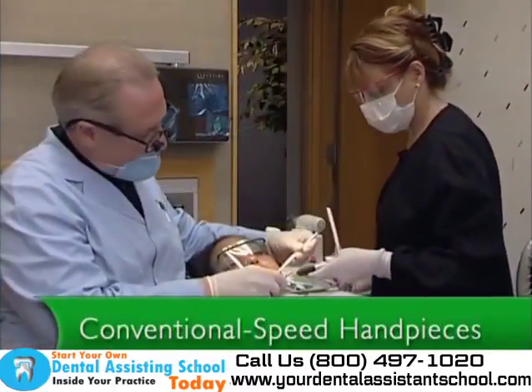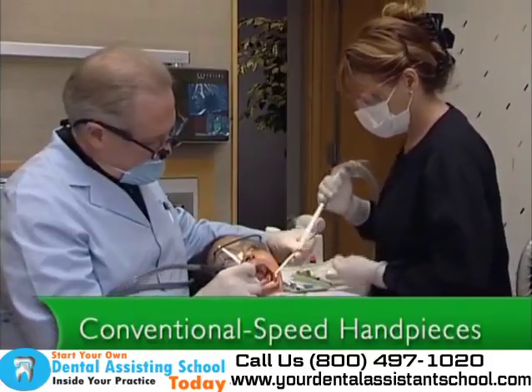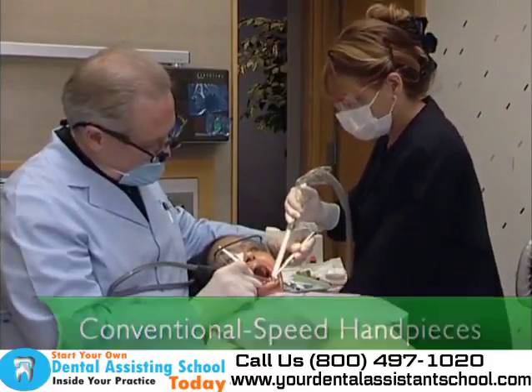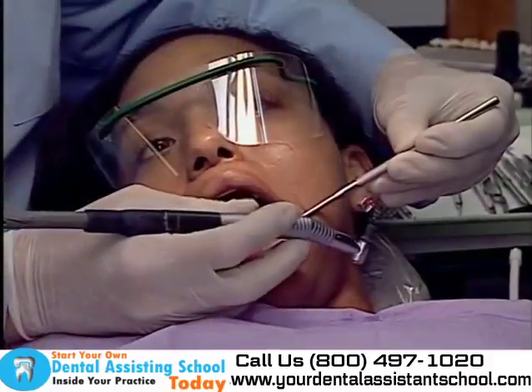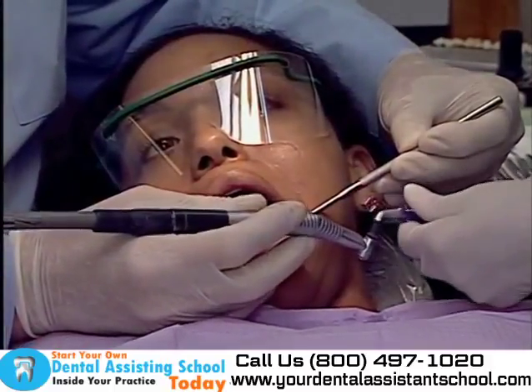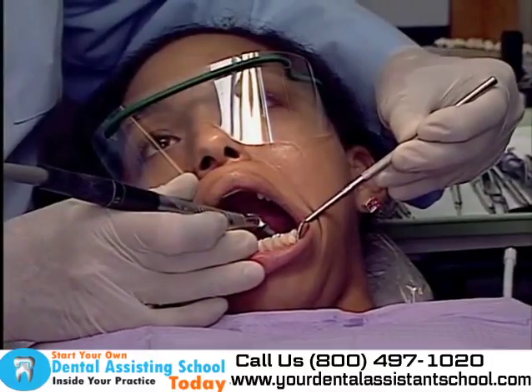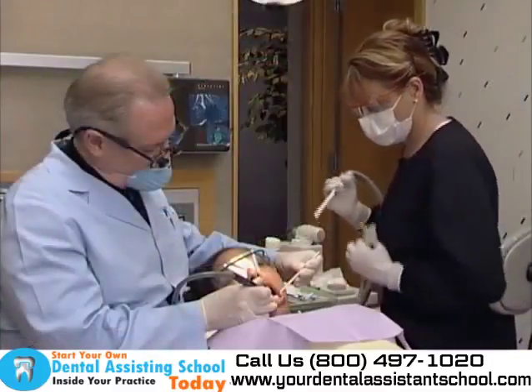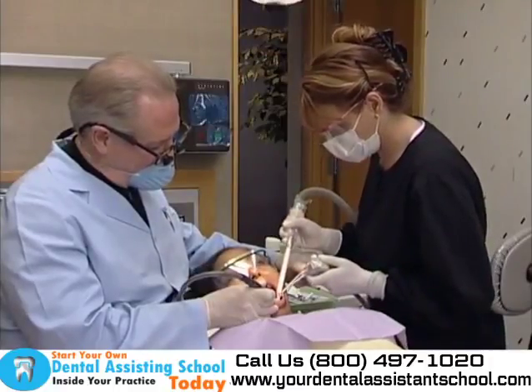The conventional speed or slow speed handpieces are often used to finish and polish restorations in teeth and to remove decay and stains from teeth. Although slower than the high speed handpieces, there are times when the handpiece produces friction. The dental assistant is responsible for using the air-water syringe to aid in heat reduction.